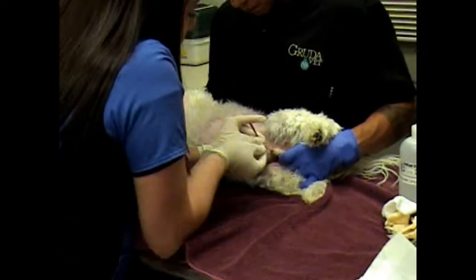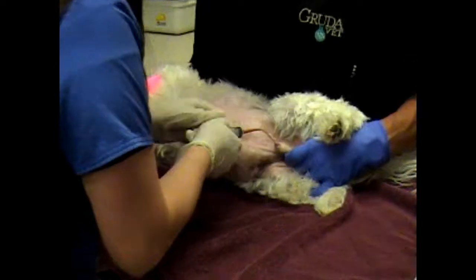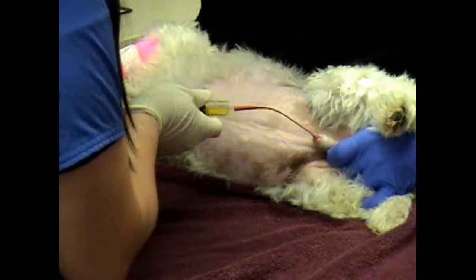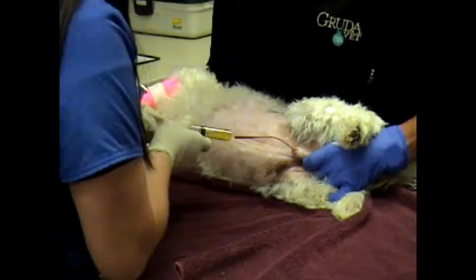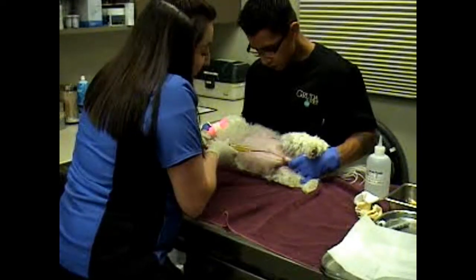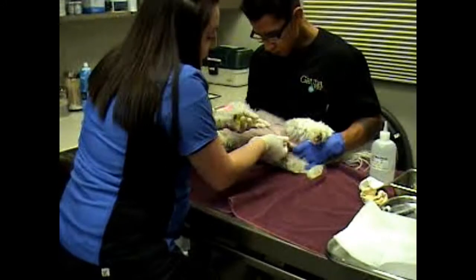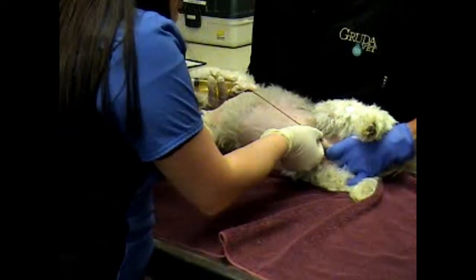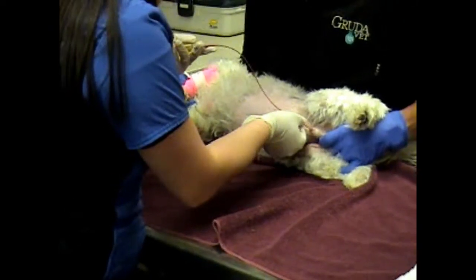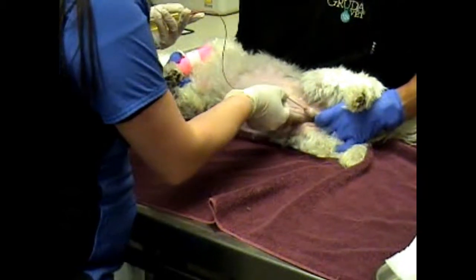And once I've got to that measured line, I'll take my sterile syringe, hook it to the catheter, and then I can pull back and I can get my sample. Ideally, because this isn't the most bacteria-free sample, we want to get as much urine as we can. Once we've got our sample, so I've got a full 12 cc's there, I'm just going to really gently pull this catheter out so I'm not causing any trauma to the penis itself. And I'm just keeping it hooked up to the syringe just to catch all that urine.